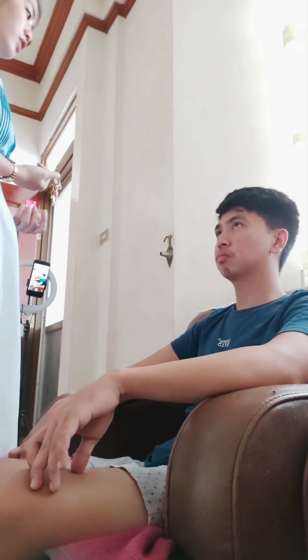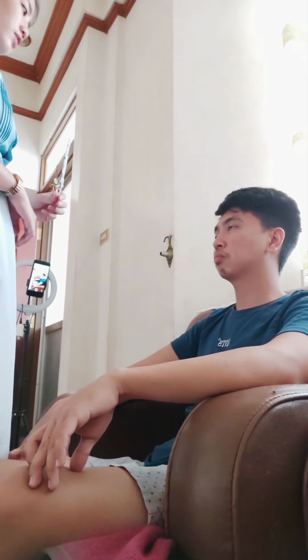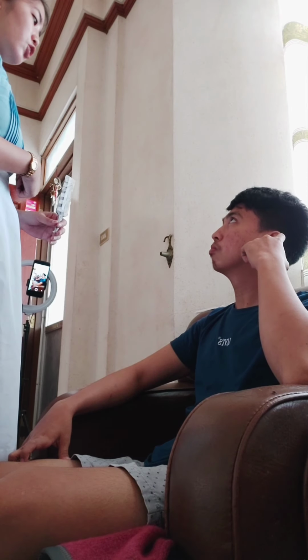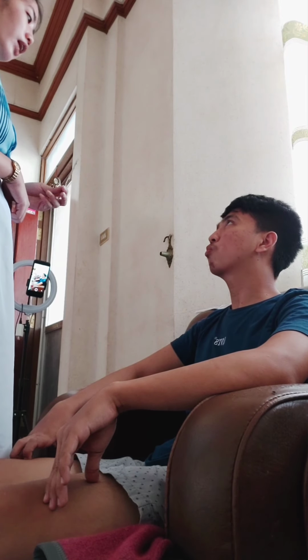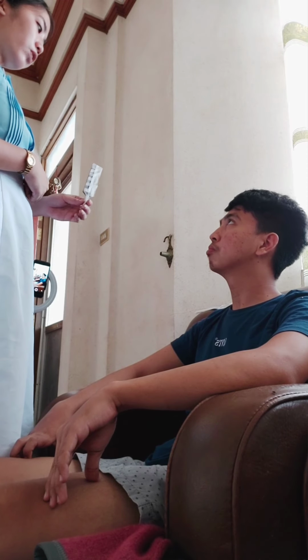First, I will explain the procedure to the patient. Sir, I'm going to put this vibrating tuning fork in two positions. One touching the bone near your ear, then one a short distance from the ear. I want you to tell me in which position you hear the tuning fork loudest, okay? Okay, then now I will strike the tuning fork and place it on the mastoid bone behind your ear.